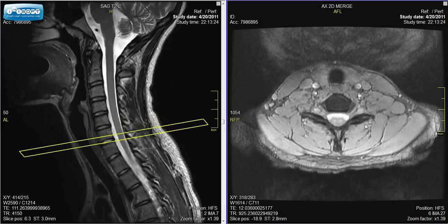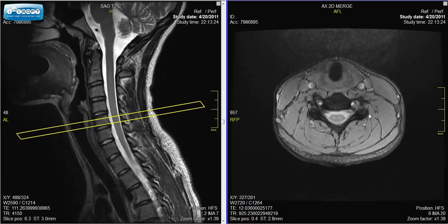Once again, we're looking at normal anatomy. If you look at some of our other videos, we'll show examples of things that can go wrong.